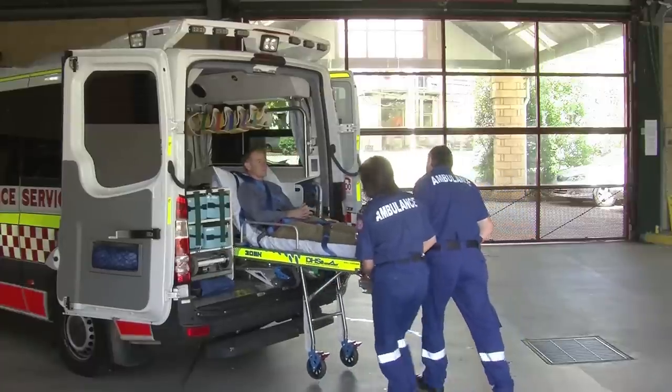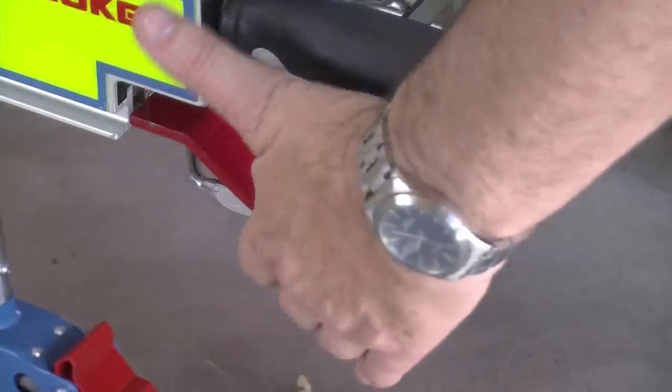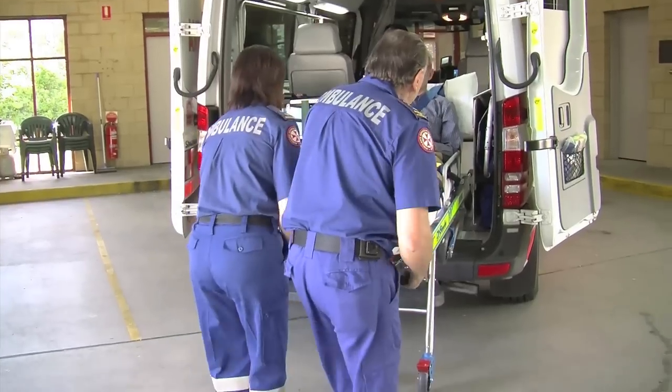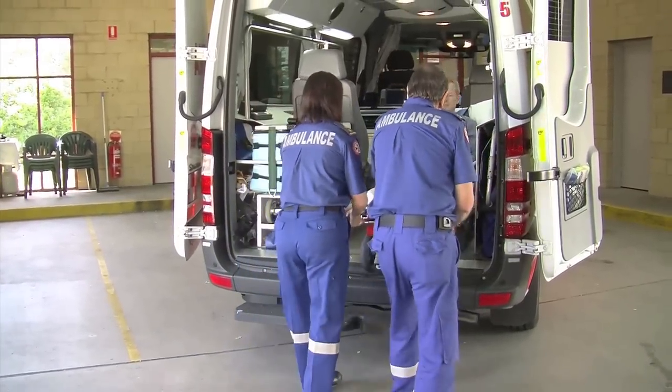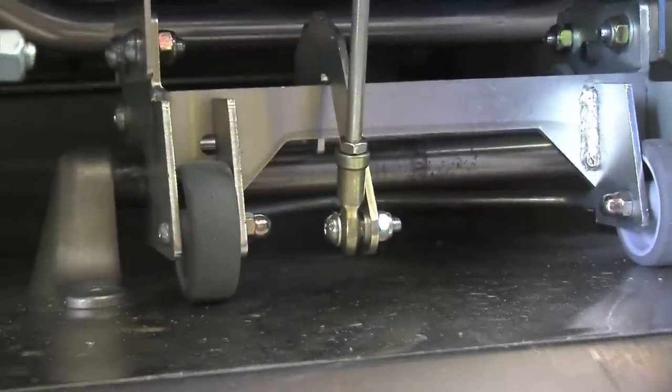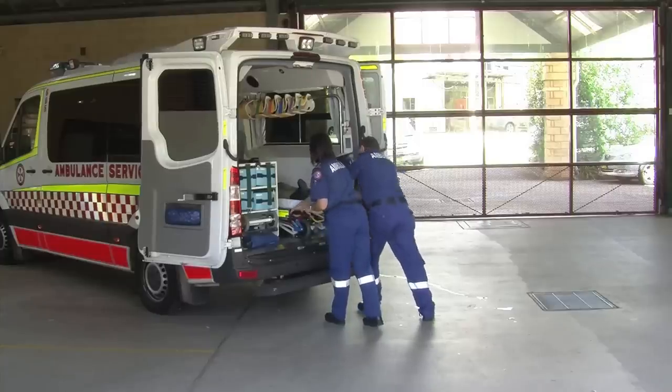When the rear legs connect with the vehicle, lift the left hand rear leg release lever. Then support the rear of the stretcher and push it all the way into the vehicle. When the lock engages with the locking bar, pull on the rear push bar to ensure the lock is secure.